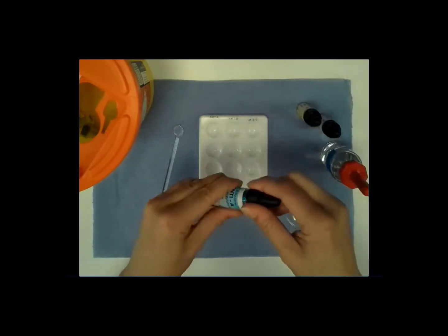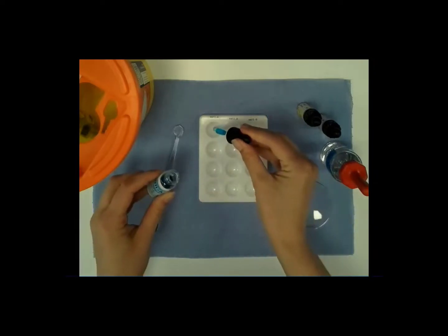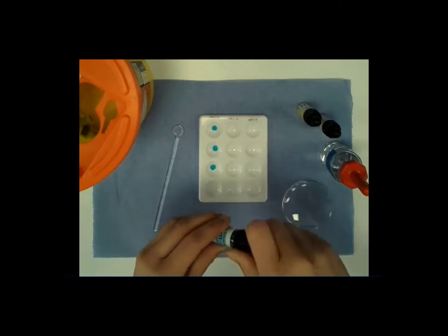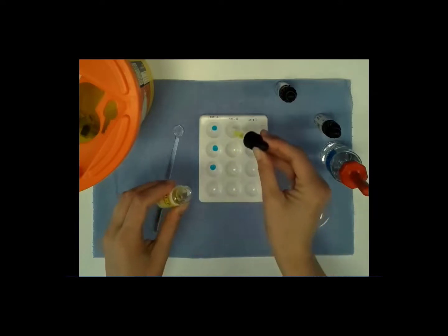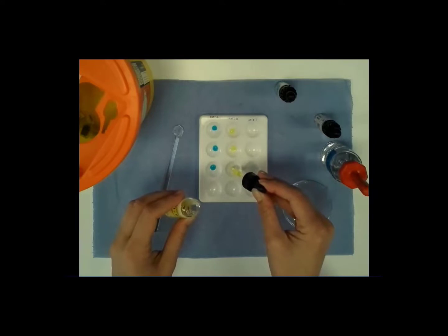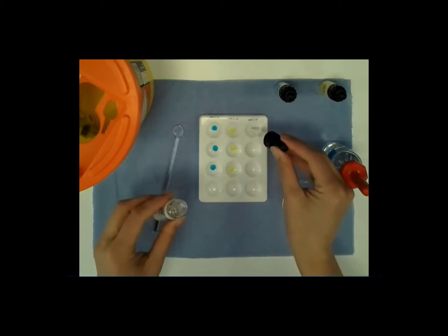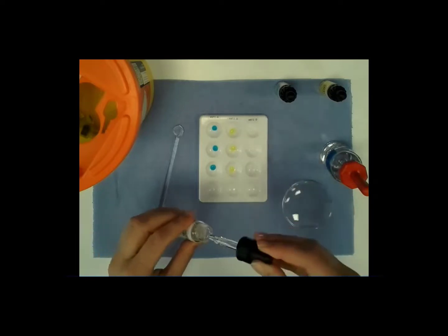First of all, you need to set up the plate. Take your antibodies and carefully add 2 drops of each to the wells in triplicate. You need to do this for each of the 3 antibodies that you've been given: anti-A, anti-B, and anti-D, which binds to the rhesus antigen. Once you've set up the plate with the antibodies, you won't need them again, so you can set them aside.